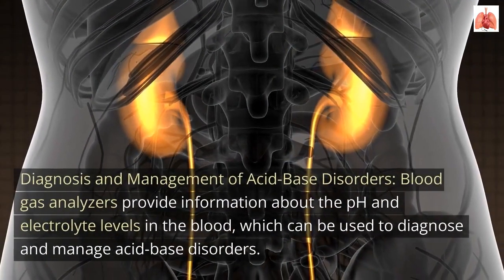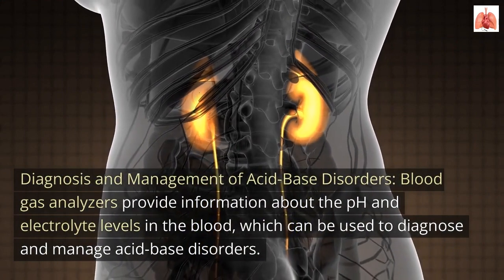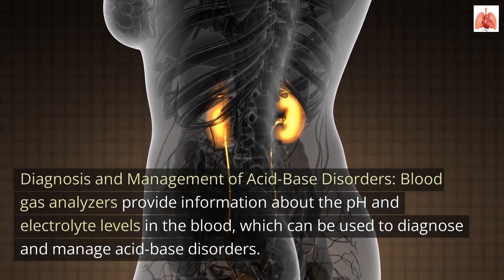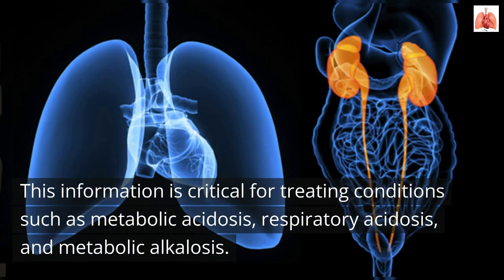Diagnosis and management of acid-base disorders. Blood gas analyzers provide information about the pH and electrolyte levels in the blood, which can be used to diagnose and manage acid-base disorders. This information is critical for treating conditions such as metabolic acidosis, respiratory acidosis, and metabolic alkalosis.